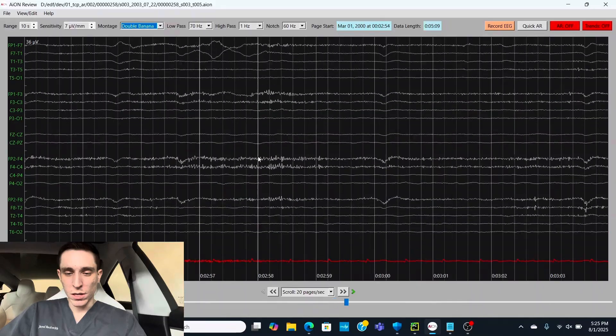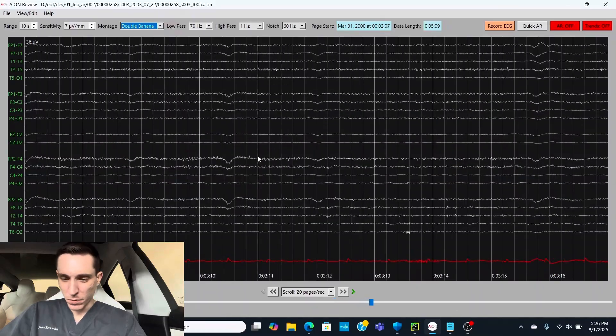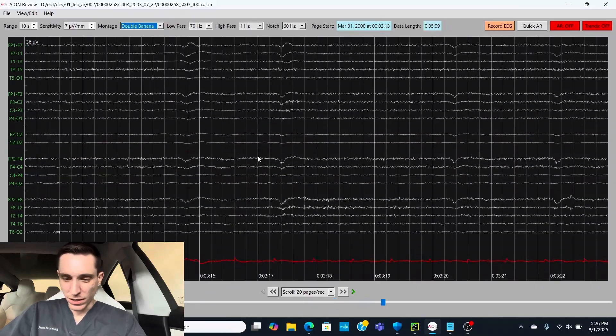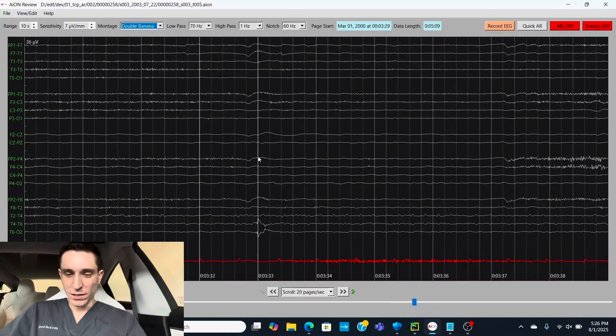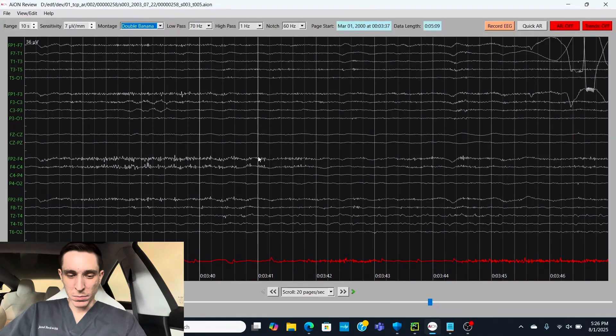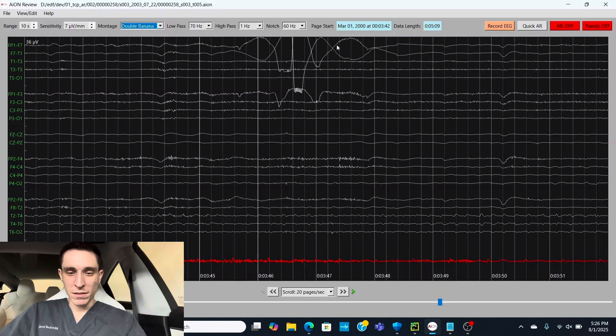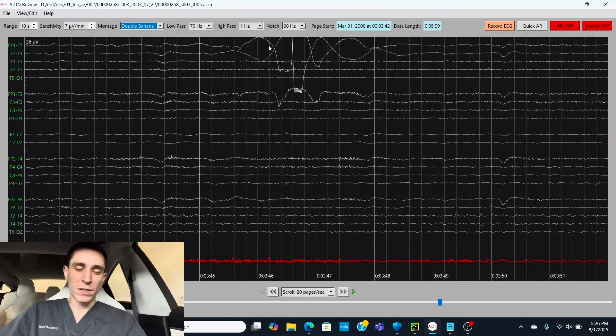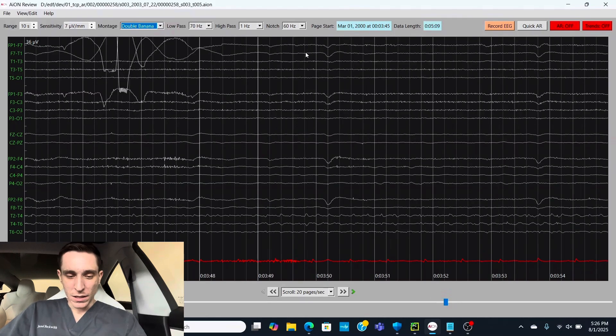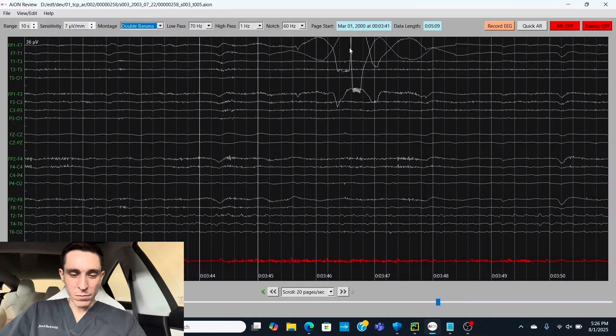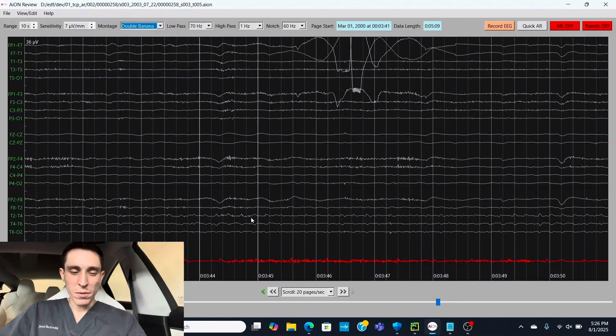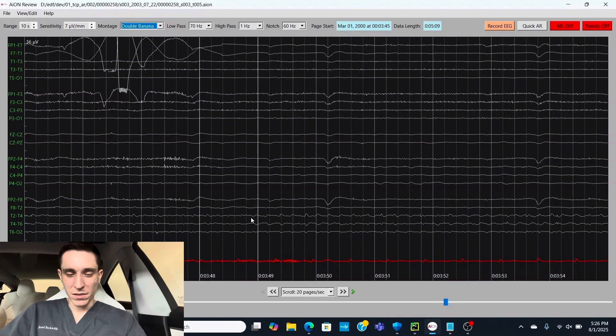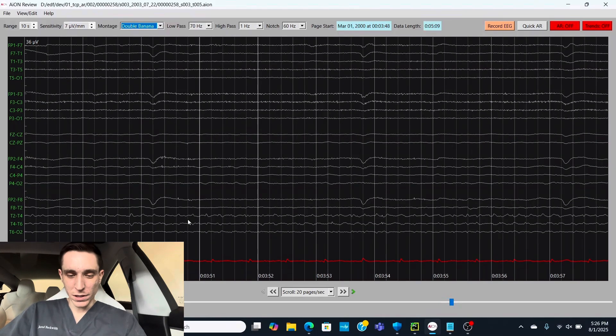And as we scroll on to the end of the clip, we can start to see something interesting. Let's see if we can get some of that epileptic activity. So here, is this the epileptic activity? No, this is probably some movement, touching the wires, electrode pop artifact. Nothing to be concerned of. But if we look down on the other side, we can see somewhat sharp activity start to originate in the right temporal region around T4.